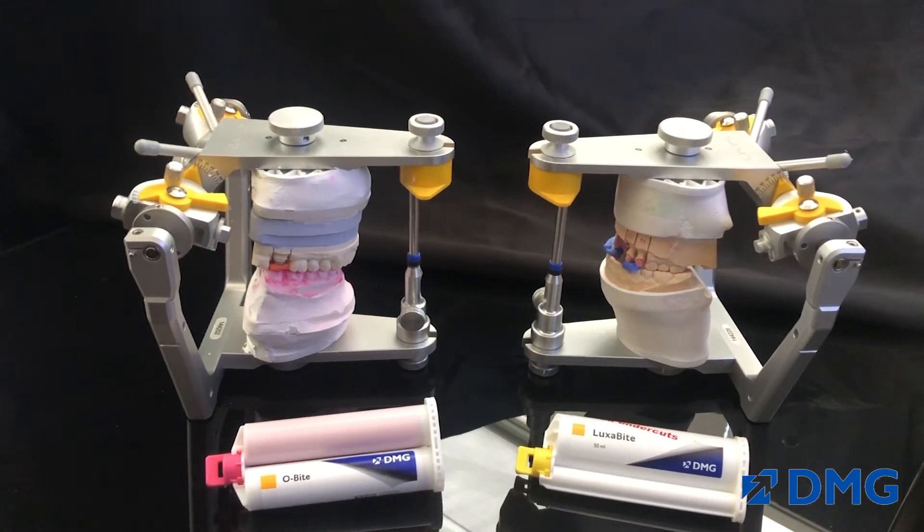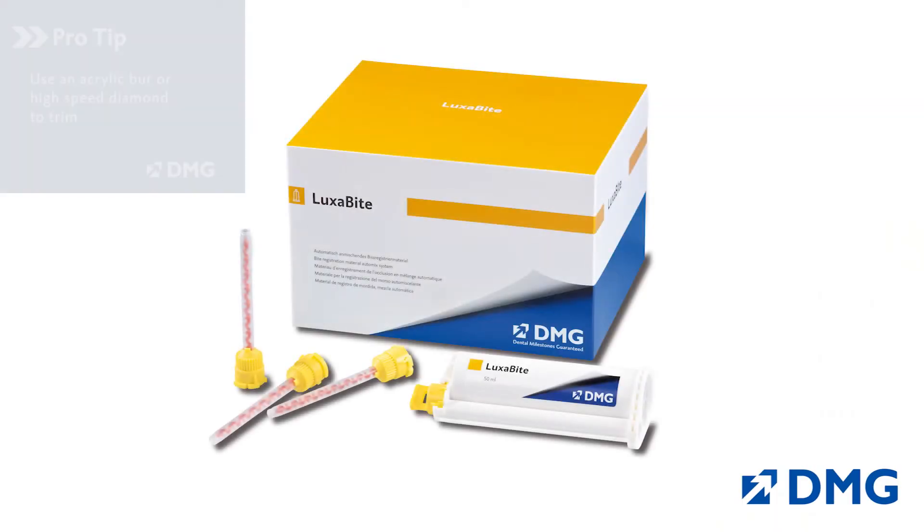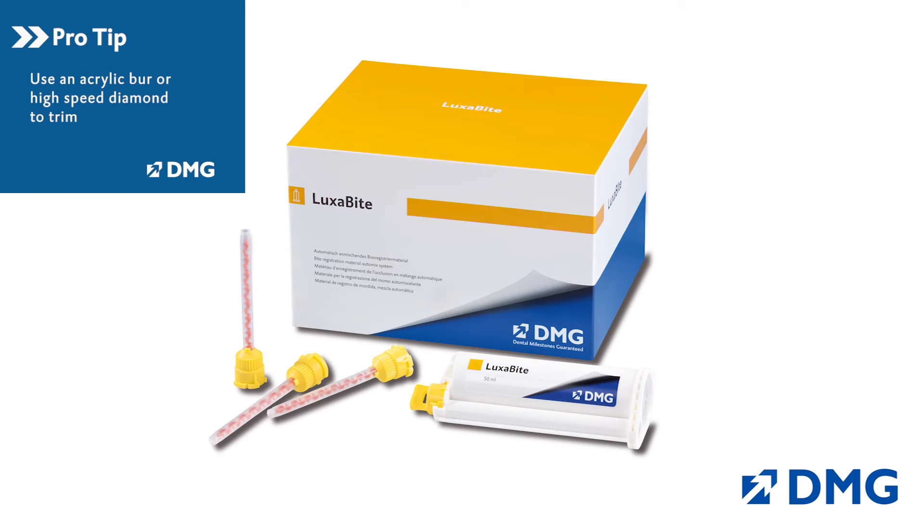Its set time is about three minutes compared to the minute and a half of the Obite, so you're going to wait a little bit longer, but you're going for that high level of accuracy. For trimming this material, you're going to use a diamond bur as compared to a scalpel.